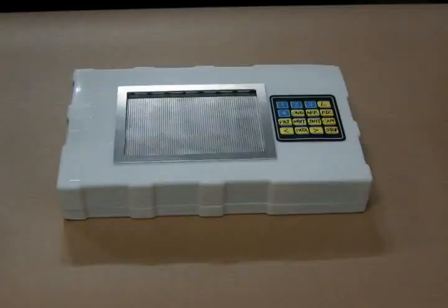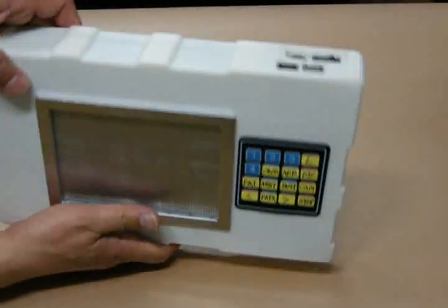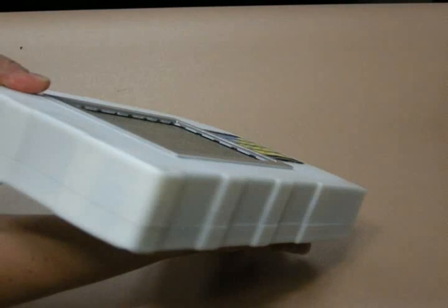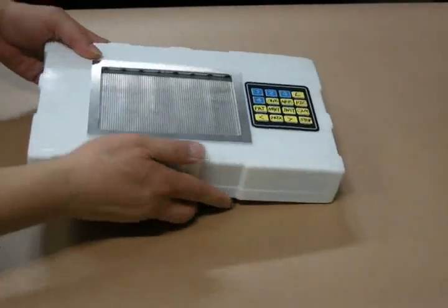Hi, everyone. I am Jung-Yu Lee, CEO of TechTactile Cooperation. Our company has been working on a new type of graphic tactile display for blind people for years. And now today, I am going to introduce this newly developed prototype device.